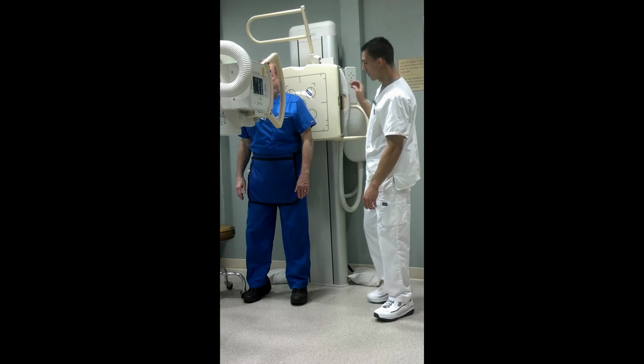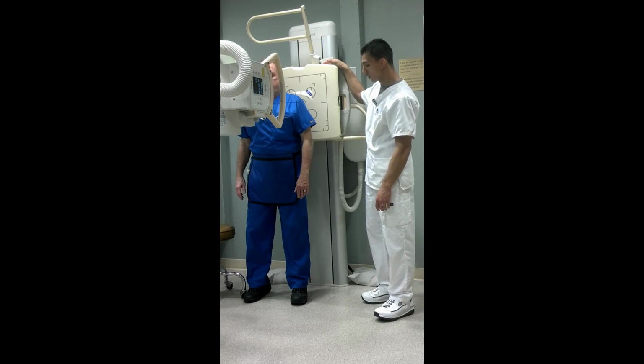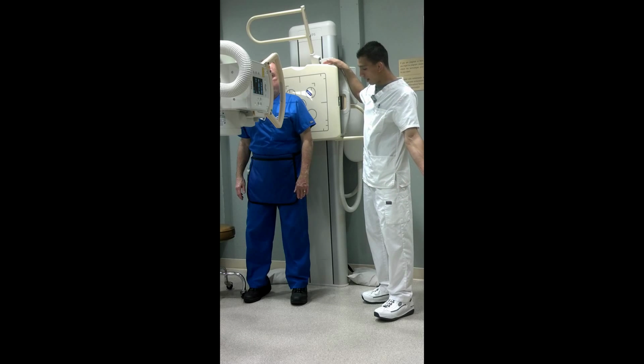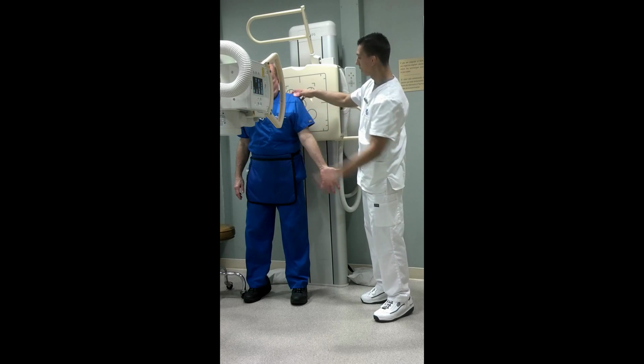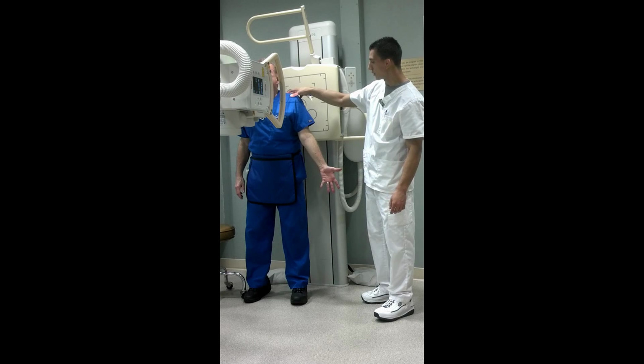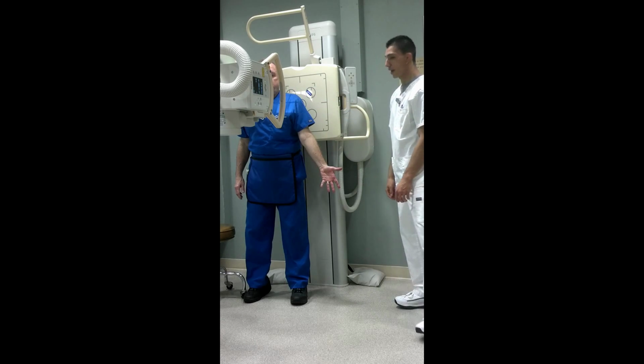and this time we'll ask the patient to do an external rotation. So we'll ask him to bring his hand outward. So go ahead and rotate your hand outward and just have it kind of hanging out there. Central ray, again, perpendicular to the coracoid process, and we'll go ahead and shoot that.